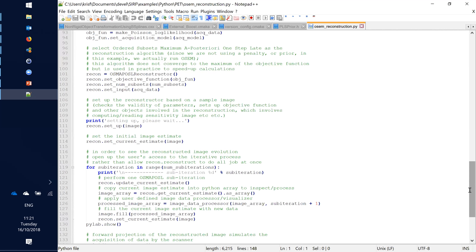But how do you work from sinogram to the scanner? Are you still using sinogram in this case, I mean sinogram in the geometrical sense, or are you using a more generic histogram, and then you know the relation for each beam? I think they will still be using sinogram. In the current code, pretty much everything is sinogram oriented, and there is some code to say that for a particular element in the sinogram, I know where the vectors are.